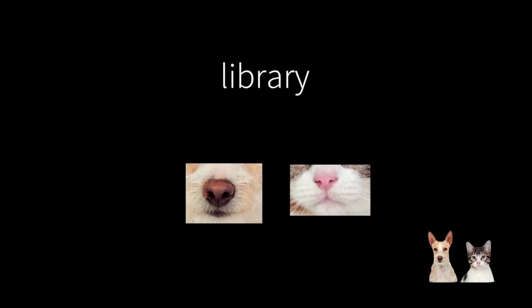When you get into the software, you will see the word library come up a lot. You see here this shape. You can tell that this is part of a cat, right? Well, this is kind of how a library works. If we just have a portion of the image, we can come up with the rest of the image if we have the data of the full image. This is basically what the library means.